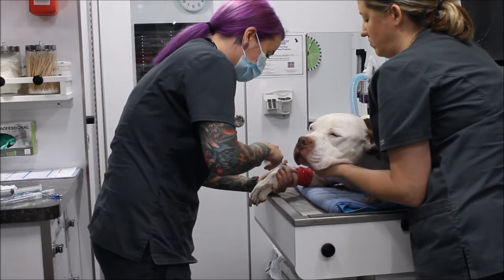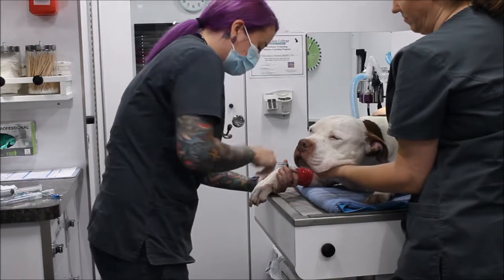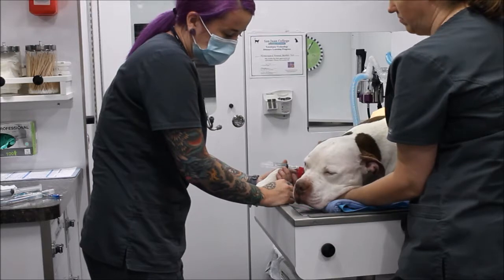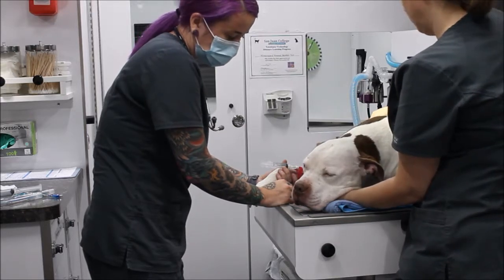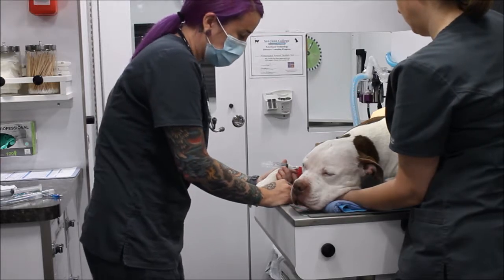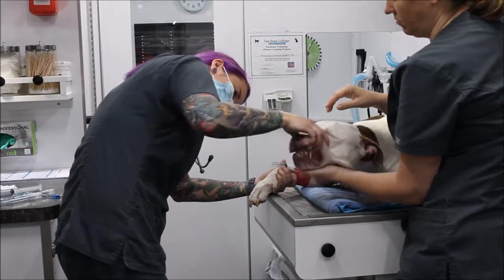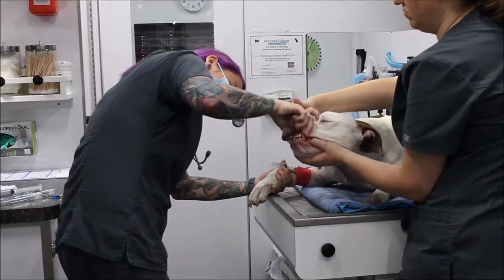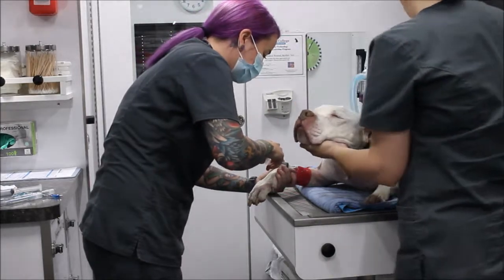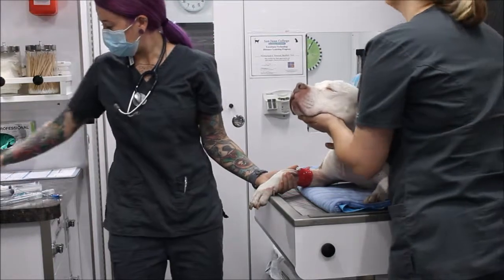A little bit more here — just going to wait a minute. I'm going to go ahead and give him the rest, and then I'm going to flush his catheter.